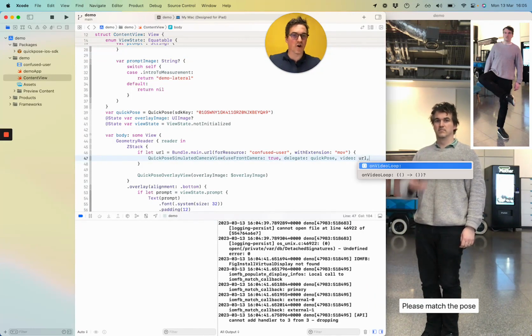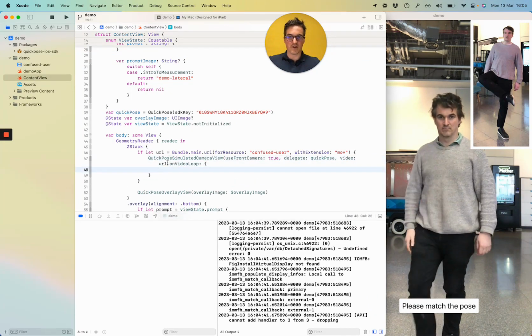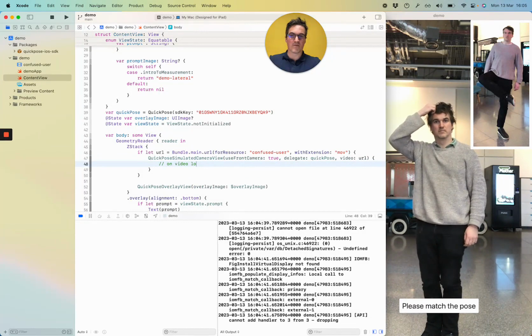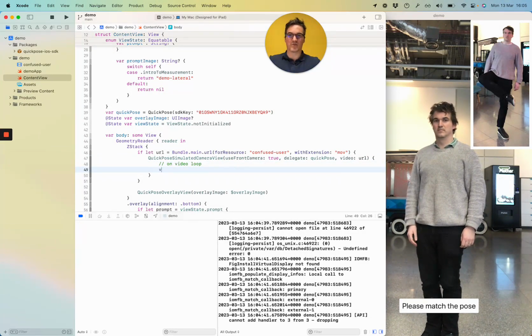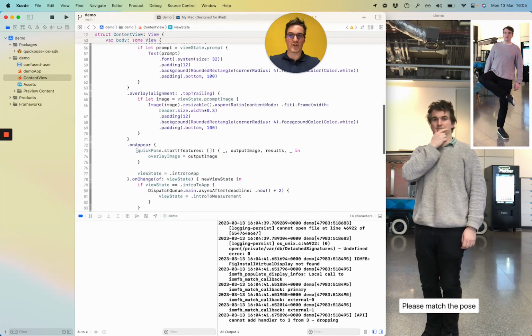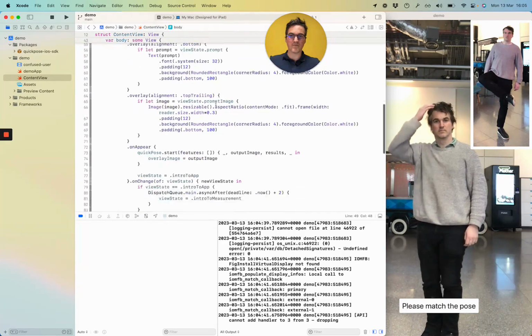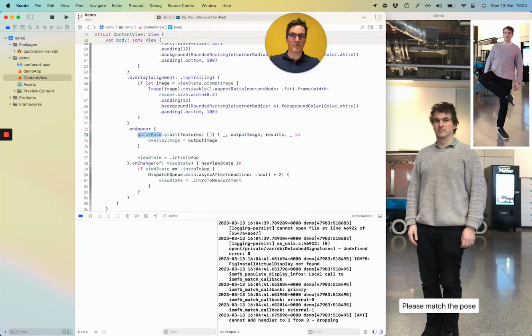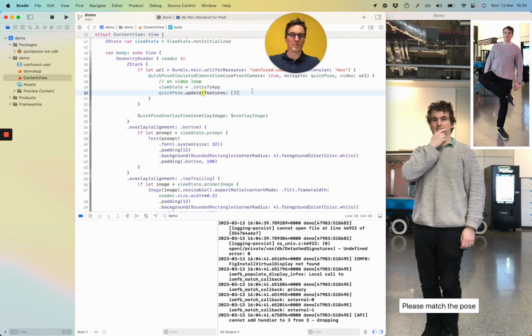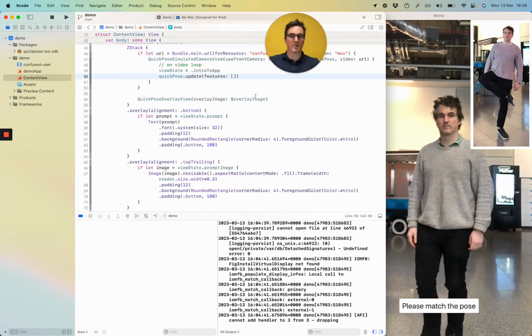It's a callback called onVideoLoop on the simulated camera view. This is a closure, so the tidier way of doing it is just to pass it on the end here. So this is on loop, and what we want to do is reset the state to not initialized, but recreate the onAppear step. So we're going to change the view to intro to app. Note we're also blanking the features on the QuickPose SDK. We'll come back to blanking the features and why that's important. Basically, if you're showing a hand measuring tool and you've reset the app, you'll still have the hand measuring tool there.